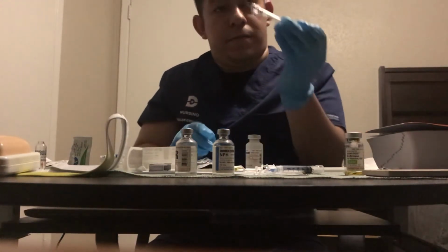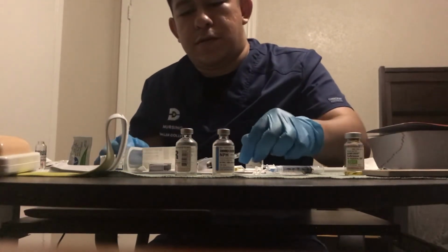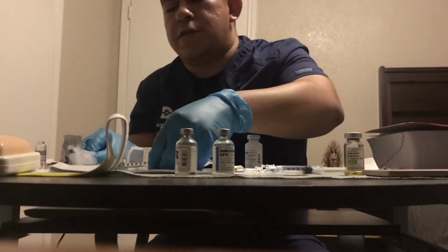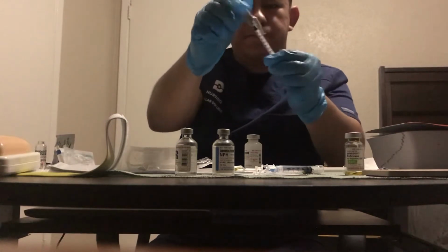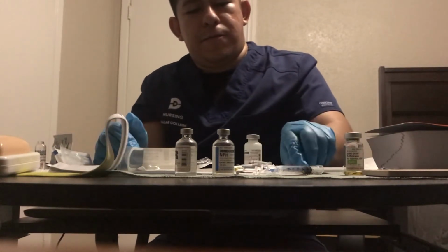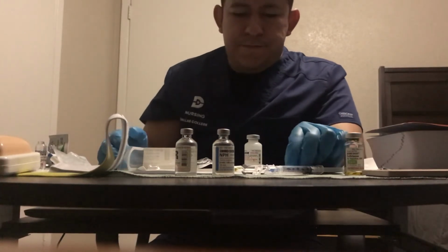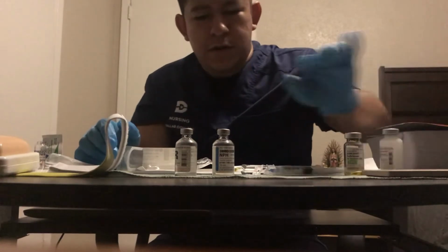Alright. Once you've made sure you have it, you're going to recap it by using the scoop method against something hard. Once you got it, cap it. And of course, you would label that too, or anything you take with you. Put that where it belongs.